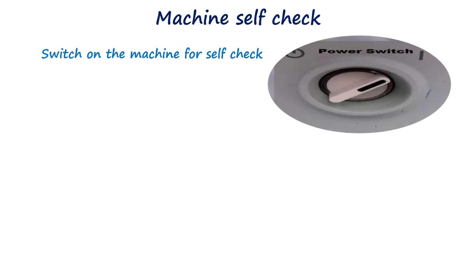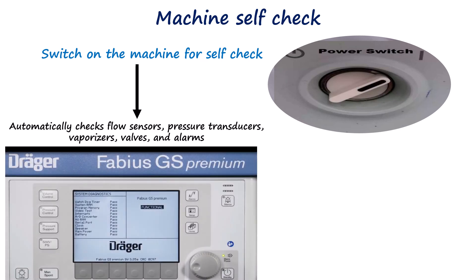After confirming that both cylinder and pipeline supplies are adequate, the anesthesia machine should be switched on to initiate the automatic self-check sequence. Most modern machines perform this self-test automatically once powered on, assessing internal components such as flow sensors, pressure transducers, vaporizers, valves, and alarms.